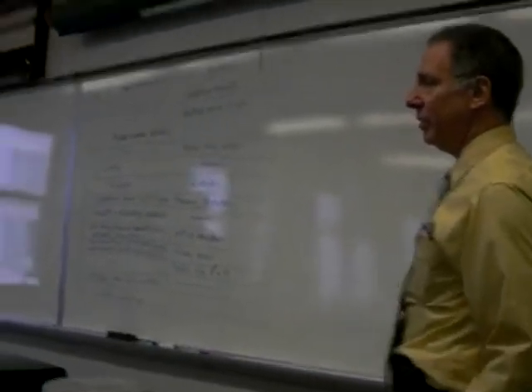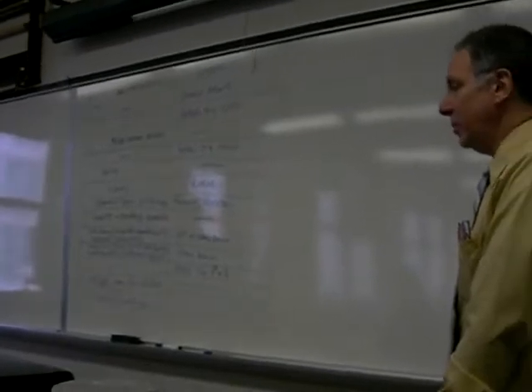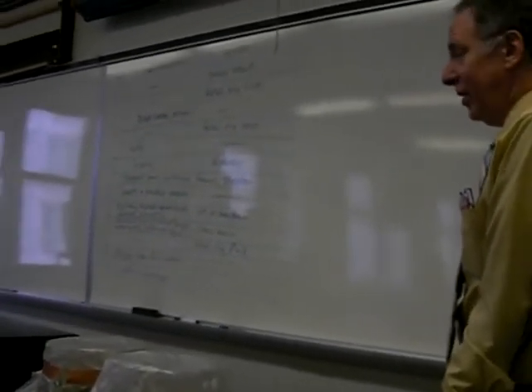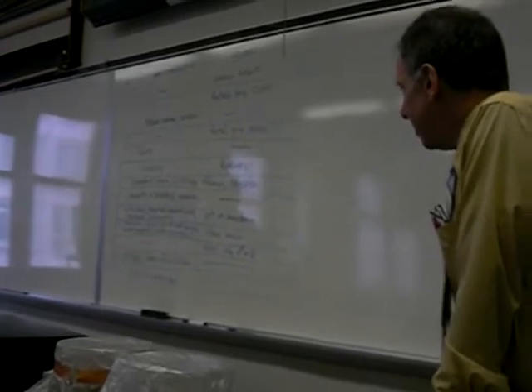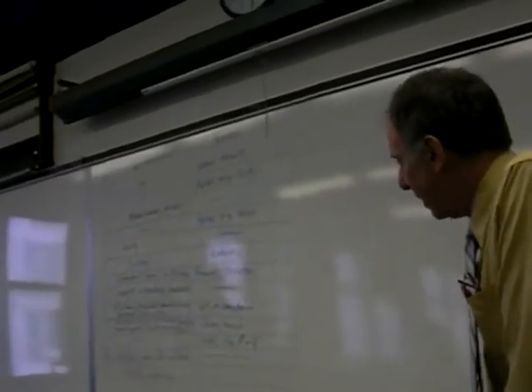Chapter 17, just smooth and striated muscle. You remember that cardiac muscle will not be on it because it really doesn't show up. Its distinguishing features are not distinguished on these slides. Number 18, we have the endocrine slides: the pituitary, the thyroid, parathyroid, the adrenal, and the pancreas.